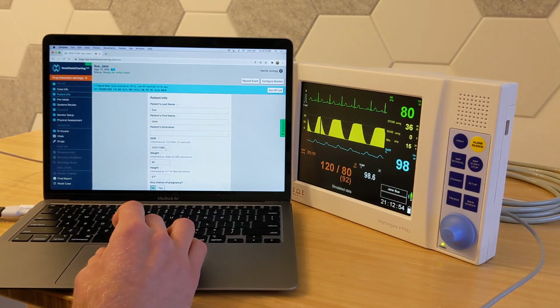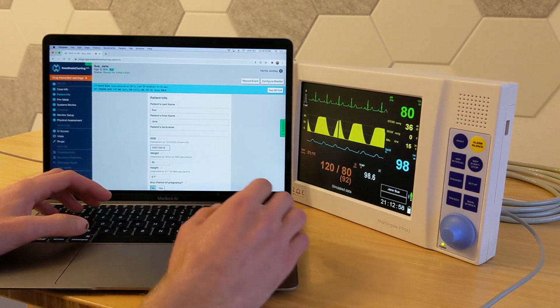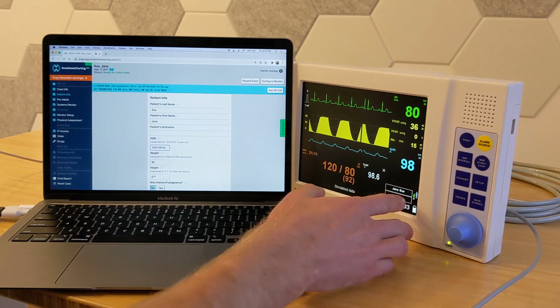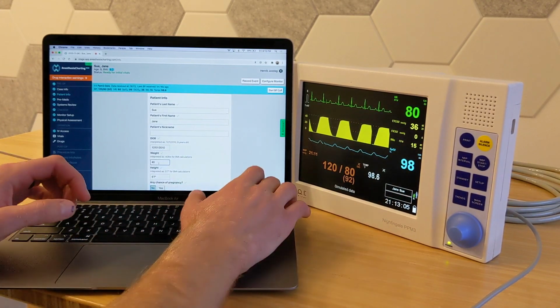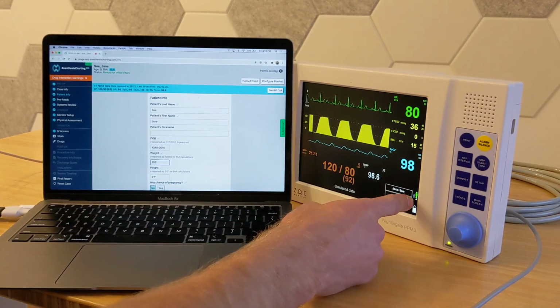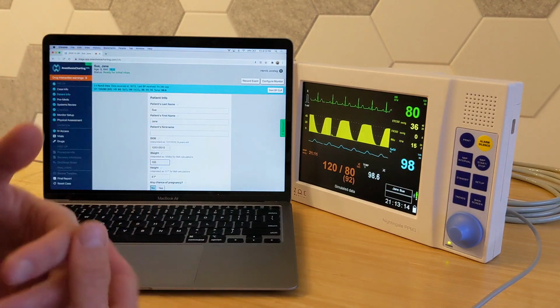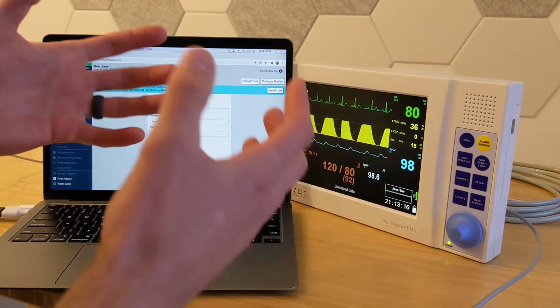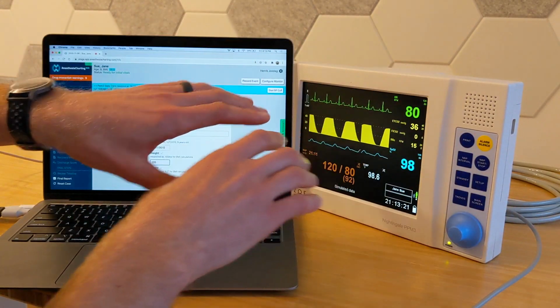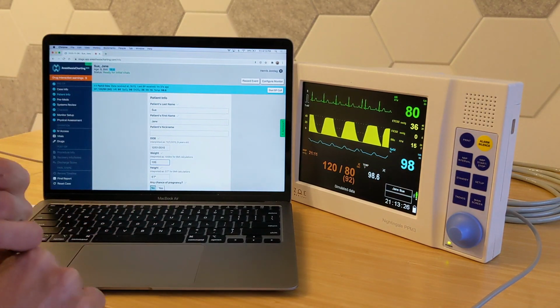So if I change the date of birth here from 1982 to, let's say, 2010, now they're a 9-year-old, it switches automatically to pediatric settings. However, if the weight is over 100 pounds, so let's call it 105, then it'll again switch back to adult settings, because at that weight, even though they're a child, they should be using the higher settings for the blood pressure cuff. So that's really the main thing it does, is it switches between whatever the adult settings you have on the monitor and the pediatric settings, but it's based, again, on the date of birth that you put in here and the weight of the patient.